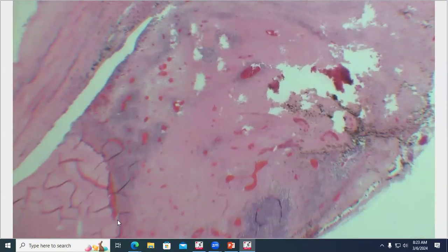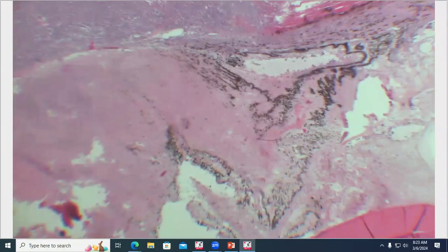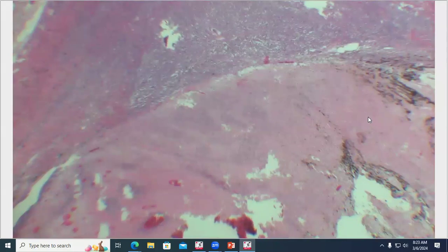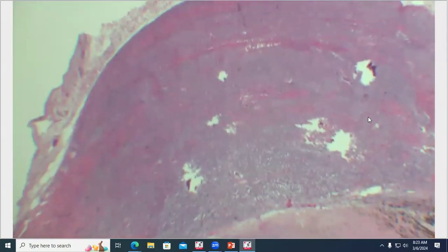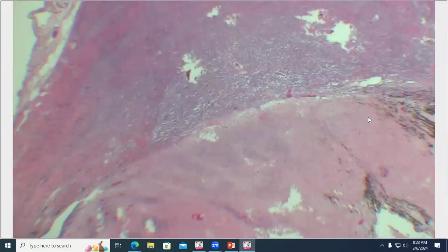Here's the other side where the iris leaflet was looking a little bit more pink. So we have some areas that are hypercellular, and then these pink areas, which are necrotic. And the same for the ciliary body. It's much more pink here, very fibrillar material for necrosis. And then we can see that hypercellularity extending out into the limbal sclera and causing that bulge there.